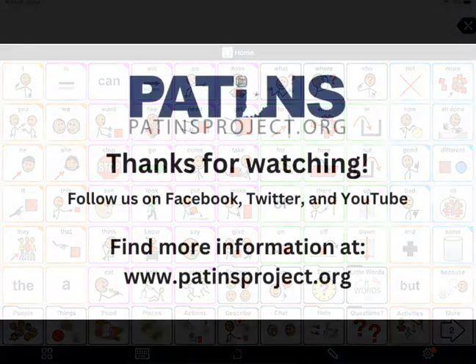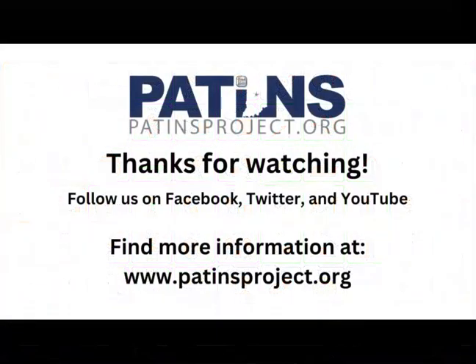There's more to learn about this software, such as customizing, editing, and setting it up for alternative access.